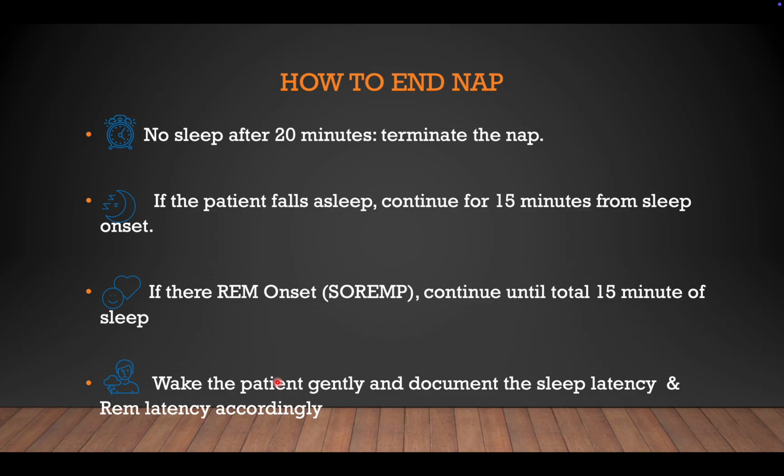Usually, if there is no sleep after 20 minutes, terminate the nap. If the patient falls asleep, you have to continue recording for at least 15 minutes from the sleep onset. Why? Because we want to see whether the patient is having REM onset or not. Once a patient has a sleep onset, we get the sleep latency, and from there we wait to see whether there is any REM onset. If there is REM onset, the SOREMs continue until the total 15 minutes of sleep.